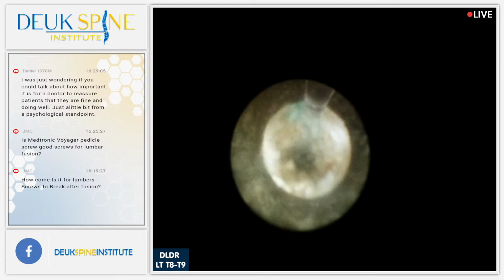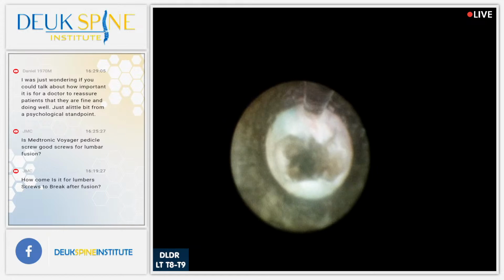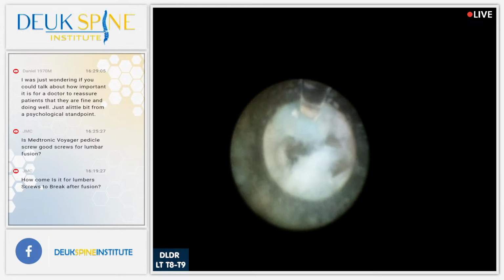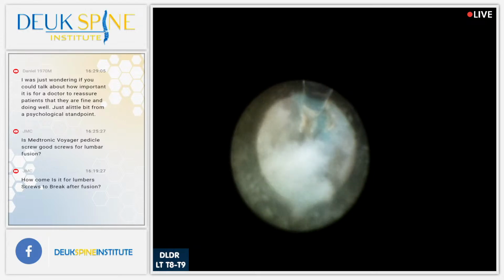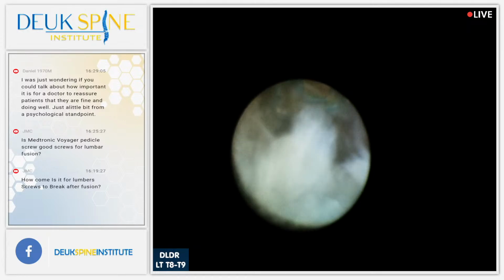We have another question. This comes from JMC once more on YouTube. Yeah, 2 minutes left, maybe 3. Go ahead, JMC. They ask, is Medtronic Voyager pedicle screws good screws for lumbar fusion?